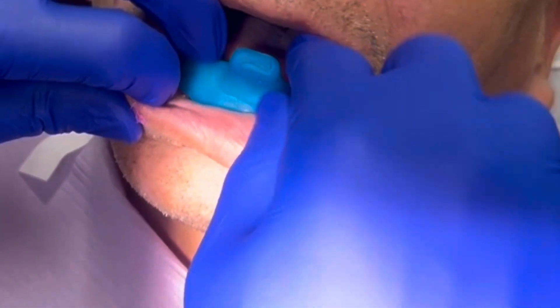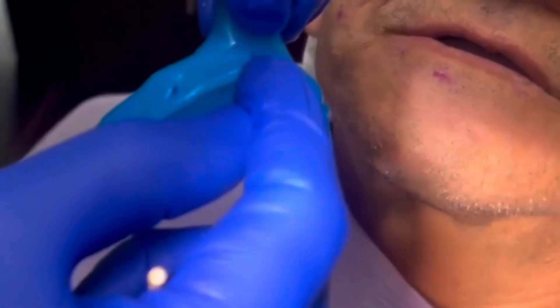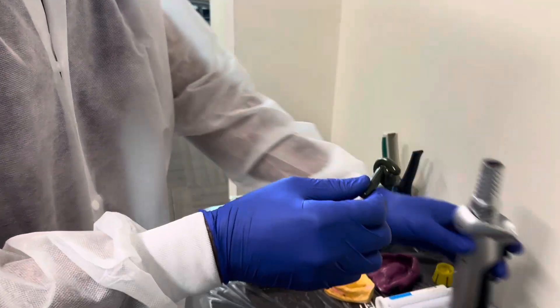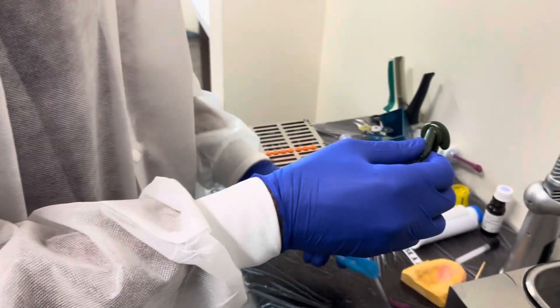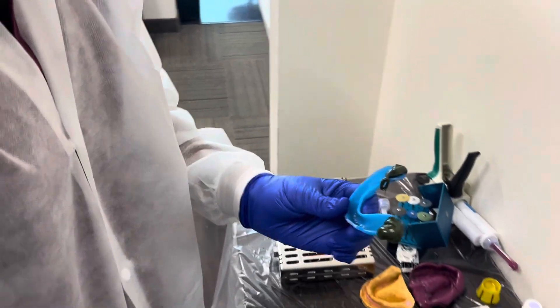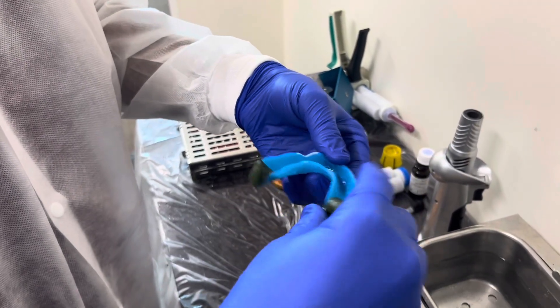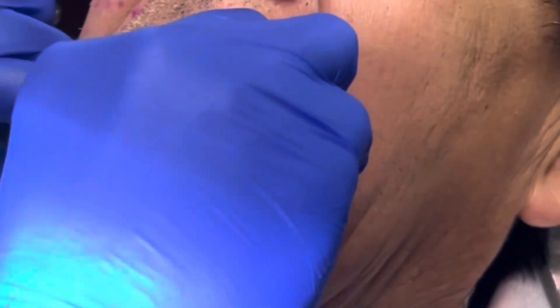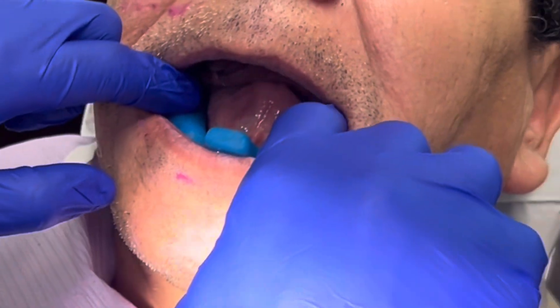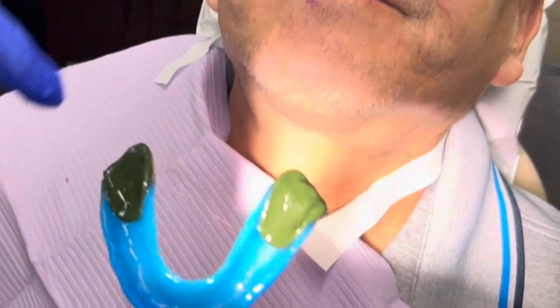Now we're going to go ahead and move on to the mandibular tray, where I'll again mark the areas that need adjusting — particularly the frenums and the border tissues. We're then going to heat up another piece of green stick compound just as we did before, but this time we're going to apply two blobs onto the retromolar pad areas, heat them up and form two little pyramids. When we seat the tray we put pressure in the back, which makes an impression of the retromolar pad areas.